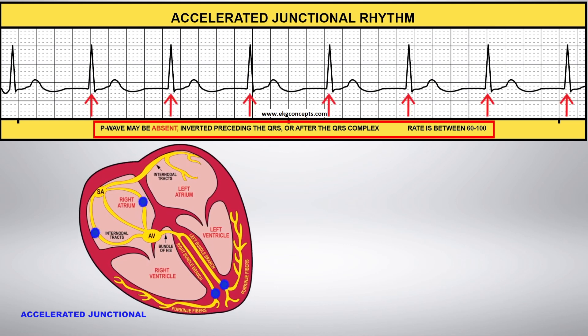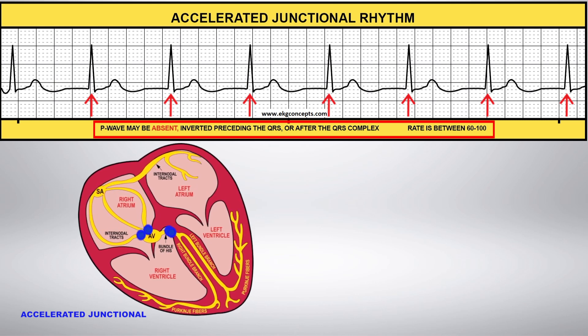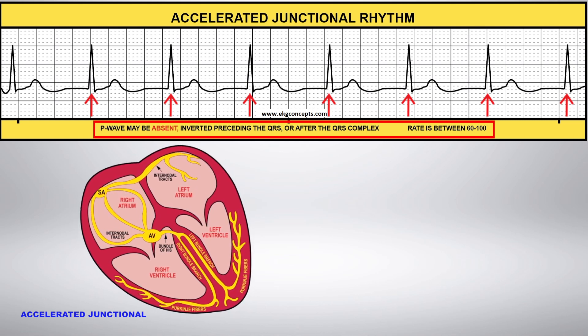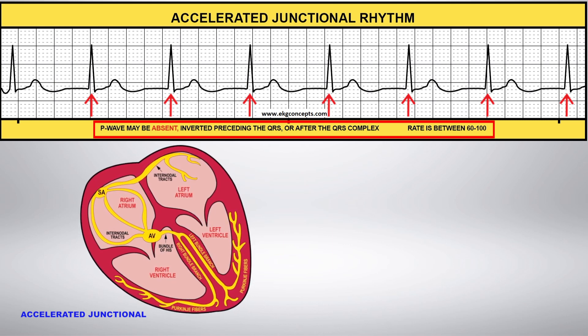As illustrated, the atria and ventricles depolarize simultaneously. This causes the P waves to be hidden within the QRS complex, as illustrated by the red arrows.